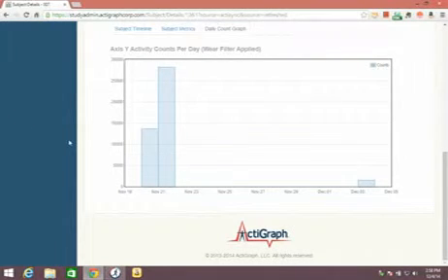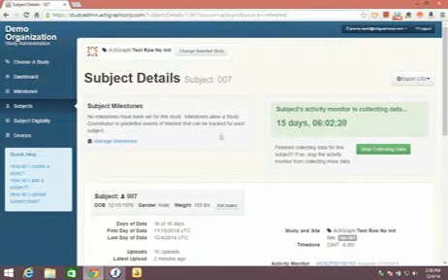Next we'll look at how to get the raw data off the device. It's very similar, very simple. But for now, I've said a lot, and I want to pause for just a second and see if we do have any questions. And if we do, I'll try to answer some of those now.